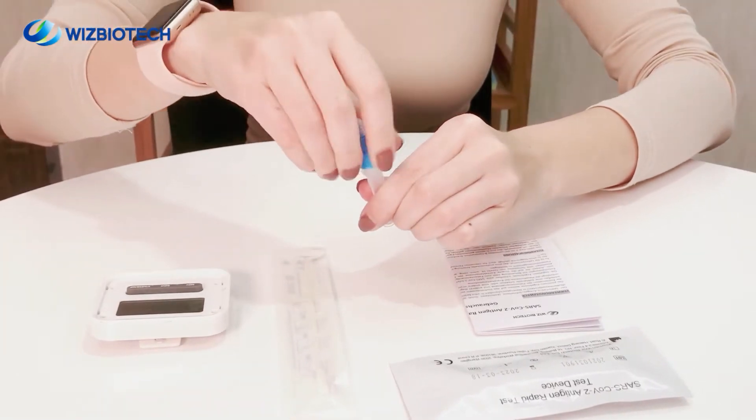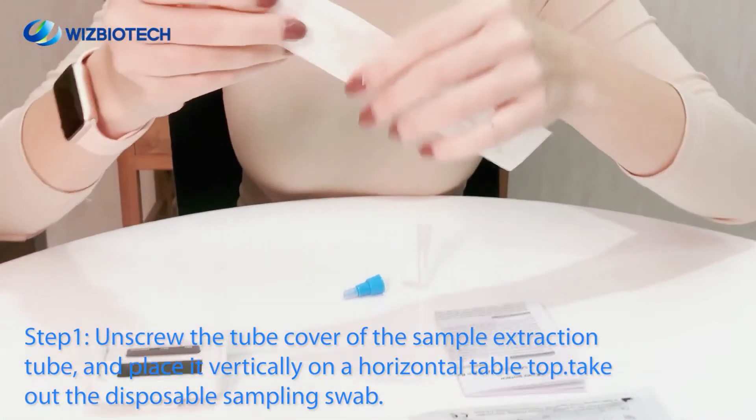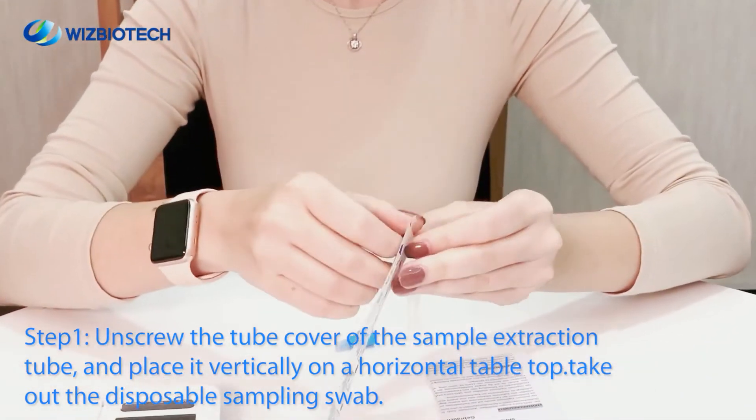Step 1. Take out the sample extraction tube. Unscrew the tube cover of the sample extraction tube and place it vertically on the horizontal tabletop.